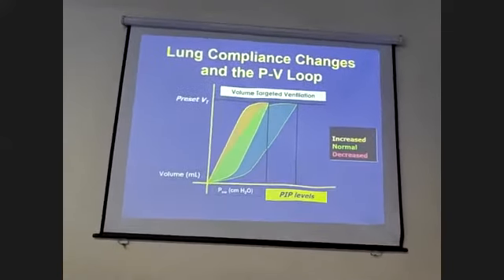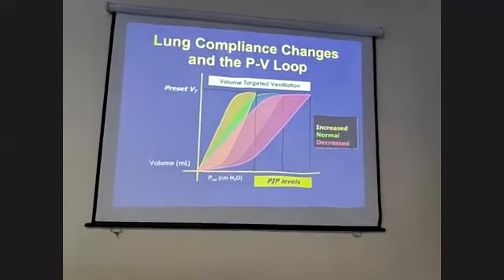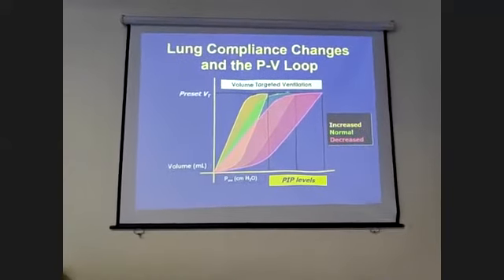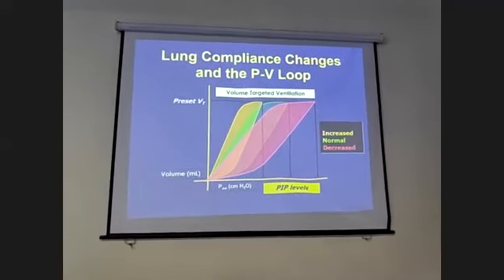That means this is the commonest thing which we do. Set the ventilator, I set a tidal volume of 500. Now you have set a tidal volume of 500. And this is what has been shown. You have fixed the tidal volume at 500 ml. Now what is happening in two different kinds of lungs?